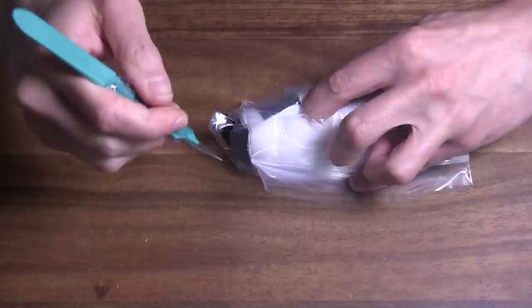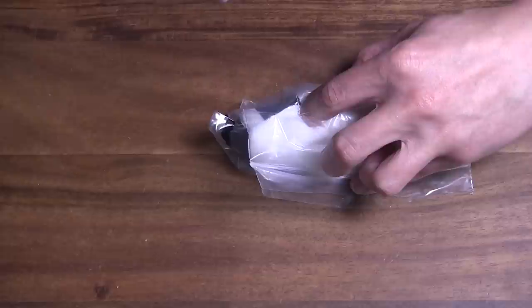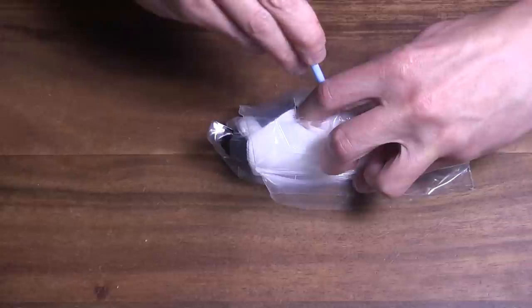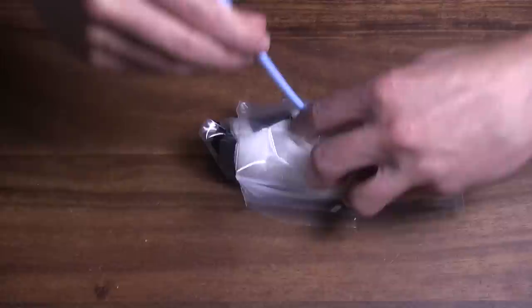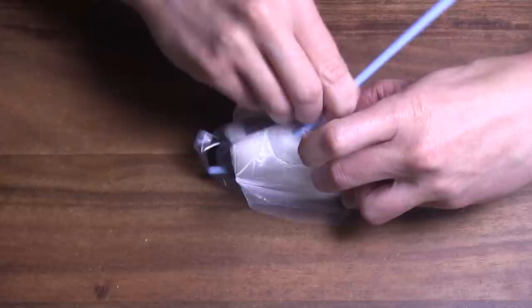Now finger, feel all the way down until the posterior wall of the cricothyroid, and it can, so my incision is big enough. Bougie comes in. Bougie slides behind the pad of the finger, because the pad's the most sensitive part of your finger. You're feeling the bougie go underneath the pad of your finger. That's the move. Bougie comes in behind the finger. Okay, I'm feeling it past the pad, and now Bougie's in.